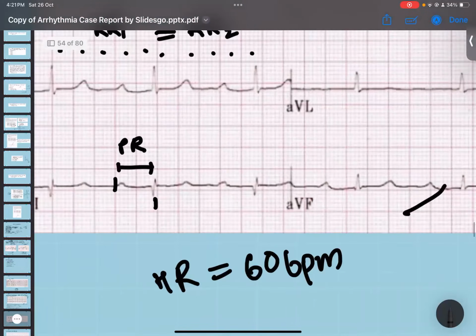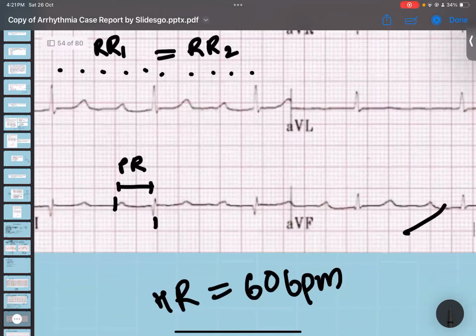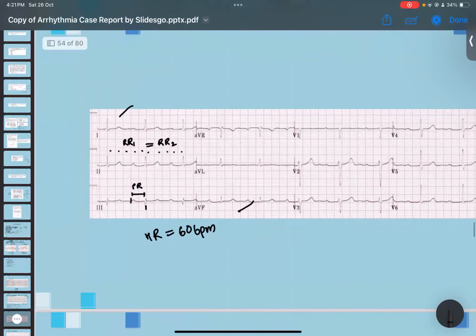However, regarding the T segments, the ST segment, that's normal. Your QRS complex is less than 3 small boxes, and your QT interval is about 1.5 box, which is normal. So the abnormal finding here is that the PR interval is too prolonged.